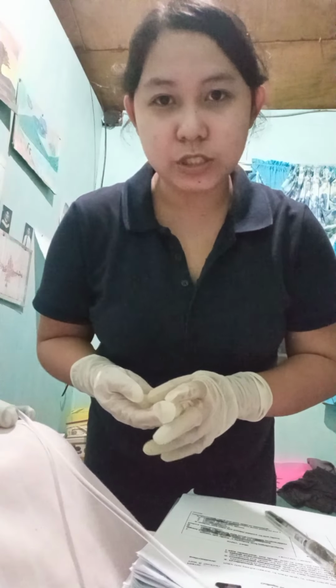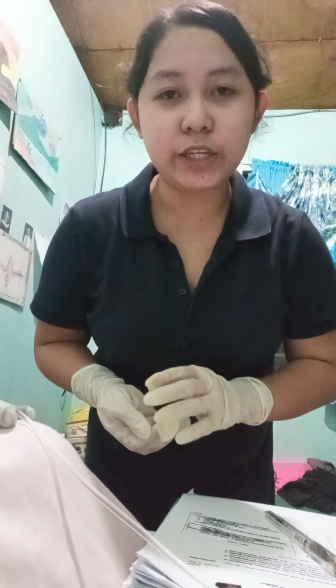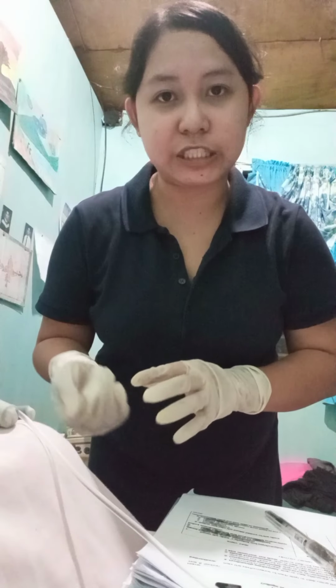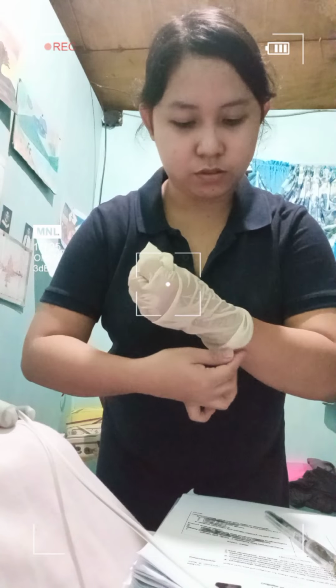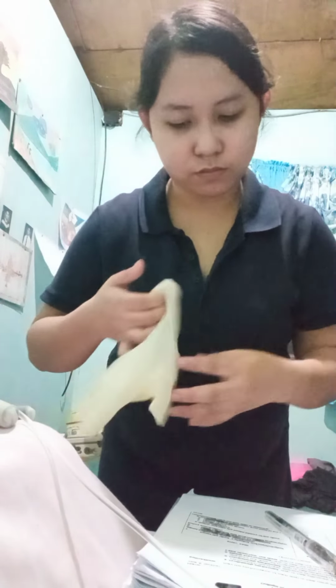After we've done the procedure, dispose of all the used needles into the sharps container. Then, remove gloves and dispose of all the materials we've used in this procedure. After that, wash your hands and document all the necessary data for the client care plan. Then, don't forget to check the client and IV site every hour.